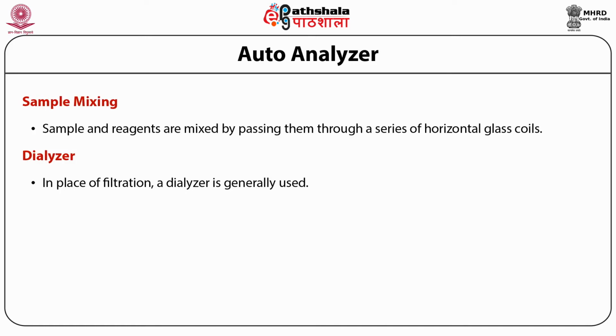The sample flows through the upper half and diffusible constituents pass through the cellophane semi-permeable membrane into the flowing stream of reagent in the lower half. The amount that diffuses through the membrane is proportional to the concentration but depends on the sample component.